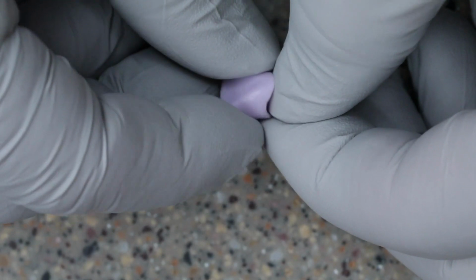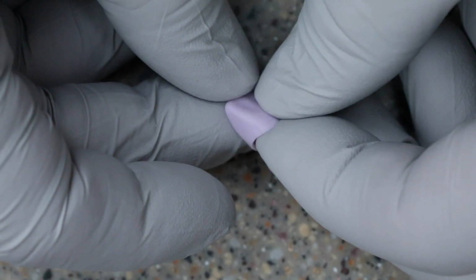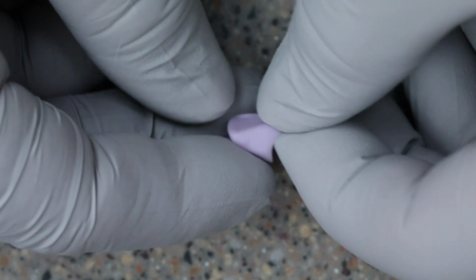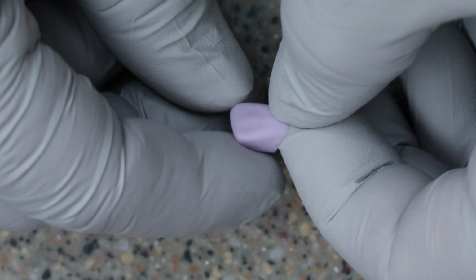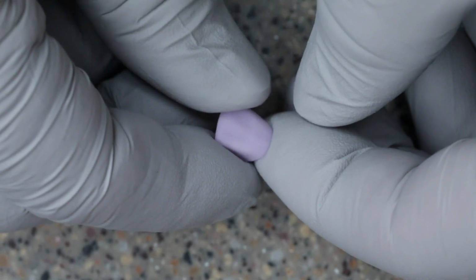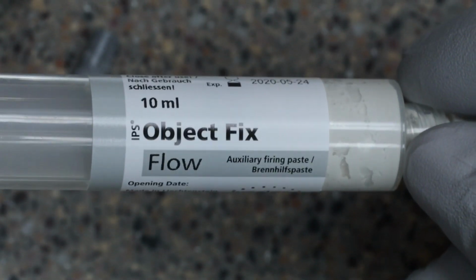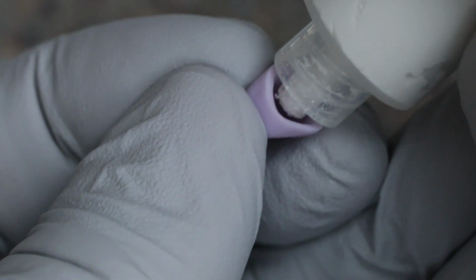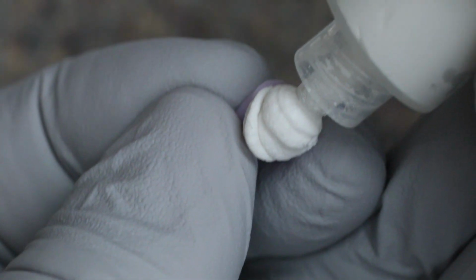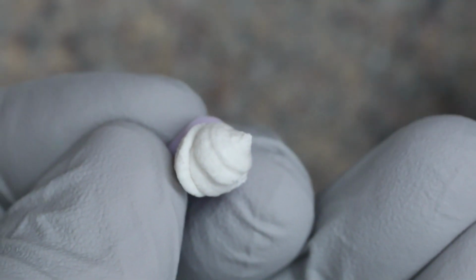All right, now we have the sprue removed, and I've contoured the crown a little bit just to smooth out where the sprue was. And I have pre-polished it with the green knife edge wheel and twist wheel. And now I'm ready to prepare this for the firing process. So let's go ahead and do that. We're going to use some object fix in the crown. We're going to place that in there, and we're going to follow that up with the crystallization peg and get this ready to fire.